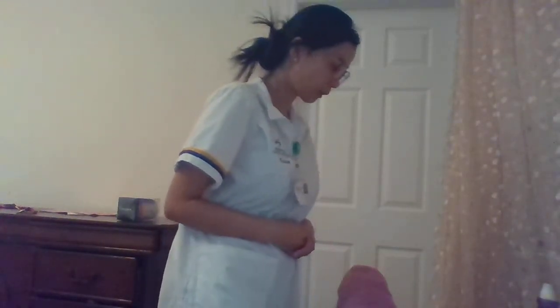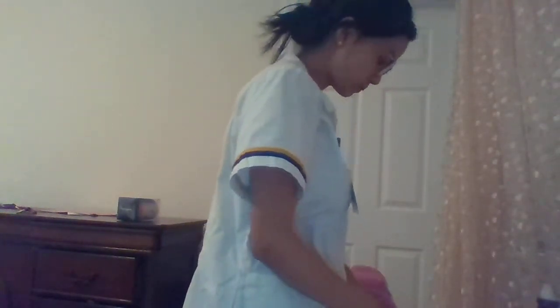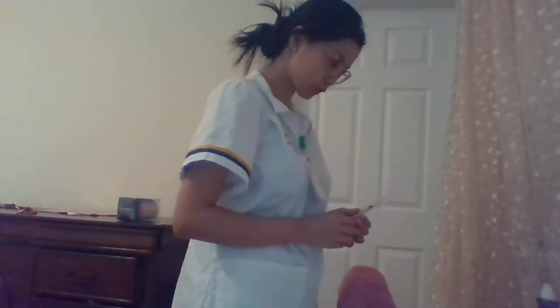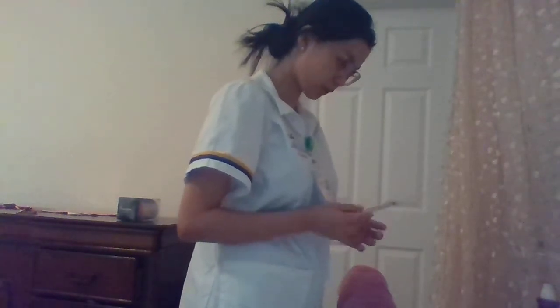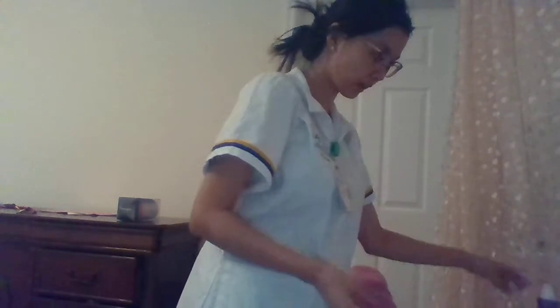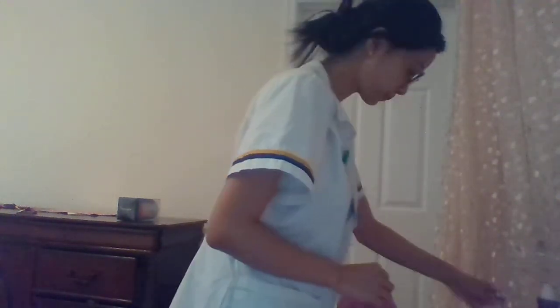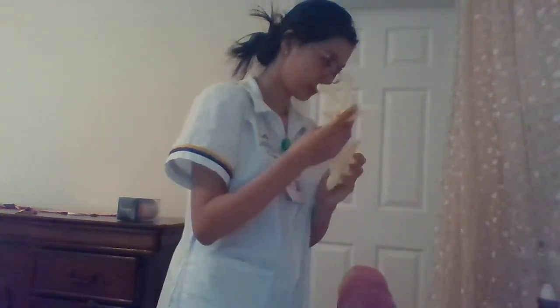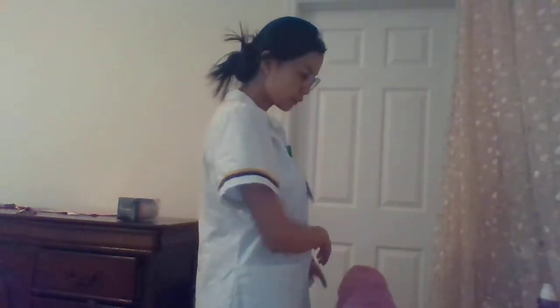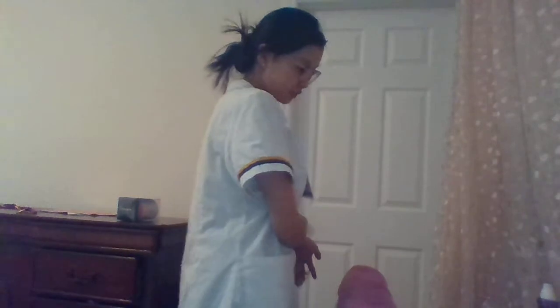I'm going to get all my supplies and equipment. For the syringe and needle, I use a 21 gauge with a 1 inch needle, and the syringe is 1 ml. And I have my gauze and alcohol pads, hand sanitizer, my labels, my vaccine, and clean gloves, and my electronic record, and the sharps container on the side for the syringe disposal.